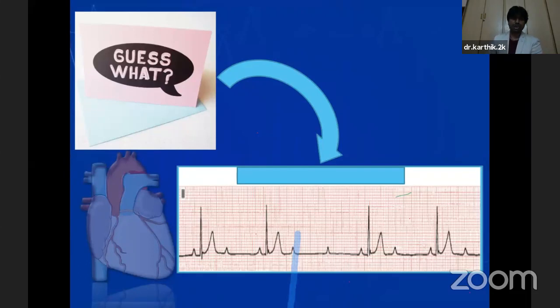approach. And then followed by that, we learned about the axis method, where we focused mainly on two important techniques, that is the perpendicular axis lead method, using lead 1 and lead AVF, and then we also tried the isoelectric method. So whichever would suit a given particular scenario, we can use that to quickly calculate the axis. And we also studied right axis deviation and left axis deviation, and a brief introduction on extreme axis deviation.